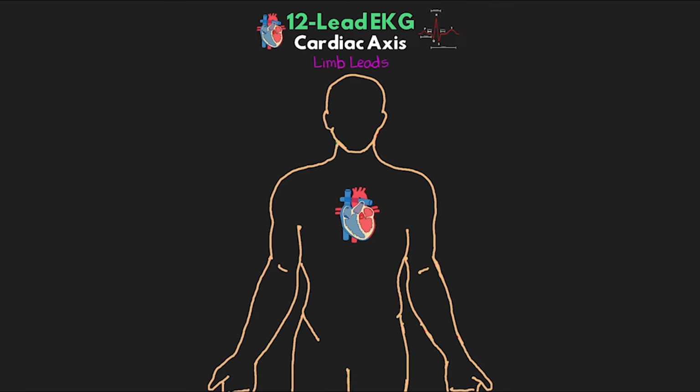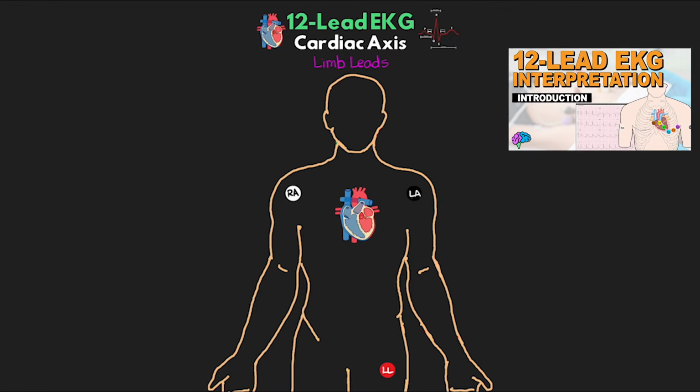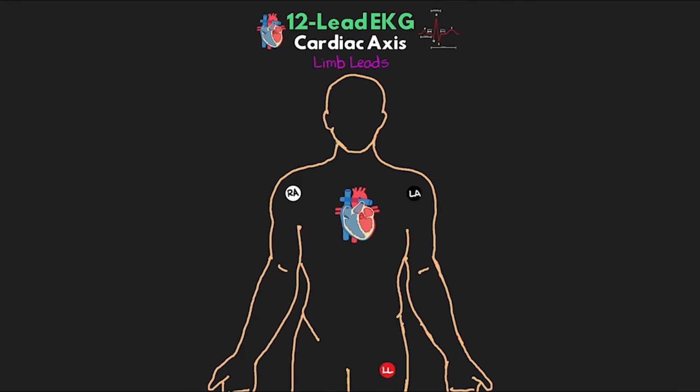So to understand how we're going to do this in just a minute, we need to also review these leads real quickly. For the purpose of this lesson, we're only going to be looking at the limb leads, so leads 1, 2, and 3, AVR, AVL, and AVF. So remember from that lesson a while ago that we're utilizing the right arm, left arm, and left leg electrodes to get these different limb lead views.